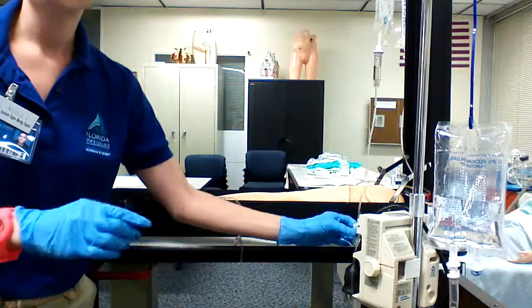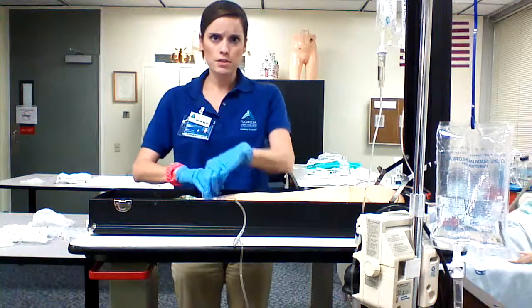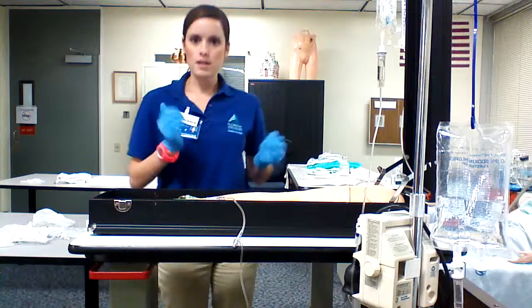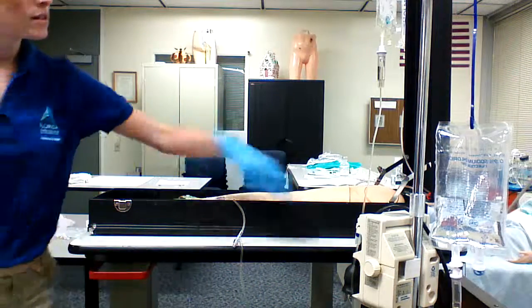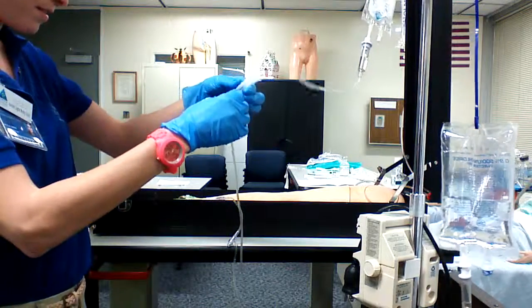Now I'm going to remove my gloves and wash my hands. I'm going to observe the infusion throughout the procedure. And when it's complete, I'm going to come back, wash my hands, apply clean gloves, and clamp the piggyback. Doing all right, Mrs. Jones? I am, Nicole. Okay, good. Thank you.